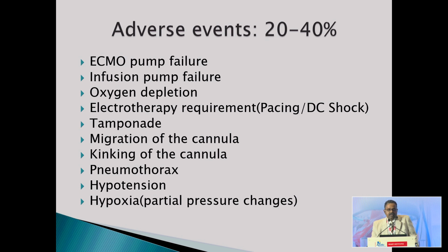When this happens, it's a nightmare for any transfer unit. At that time, place the patient on minimal oxygen requirement so that the saturation is around 75 to 80%, and then prolong the journey, rather than hurriedly having a 94 saturation and then you end up without any oxygen in the later part of the journey.